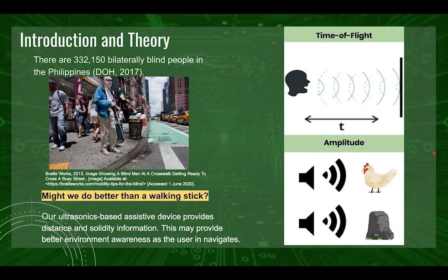Acoustic impedance is given by Young's modulus, since the elasticity of a solid object affects the speed of sound passing through it. Young's modulus measures how stiff or dense an object is. Therefore, a denser material has a greater impedance mismatch to air. For instance, gold has a Young's modulus of 78 gigapascal, whilst human skin ranges between 5 kilopascal and 140 megapascal, according to Cholera and colleagues in 2016.